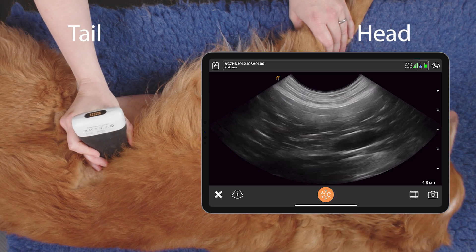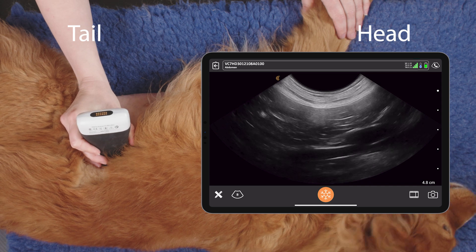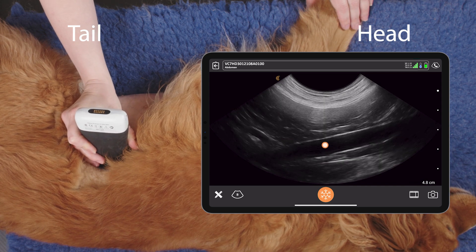We place the probe up by the aorta and we want to get a nice longitudinal view of the aorta.